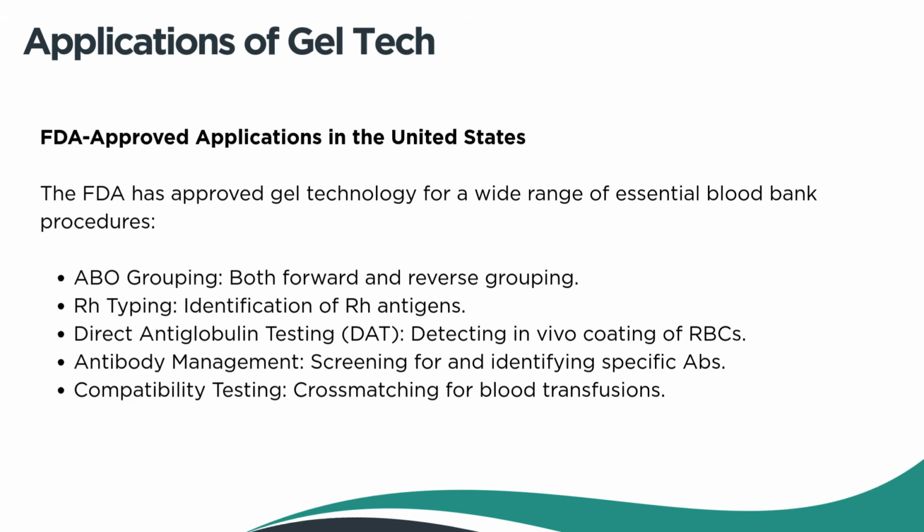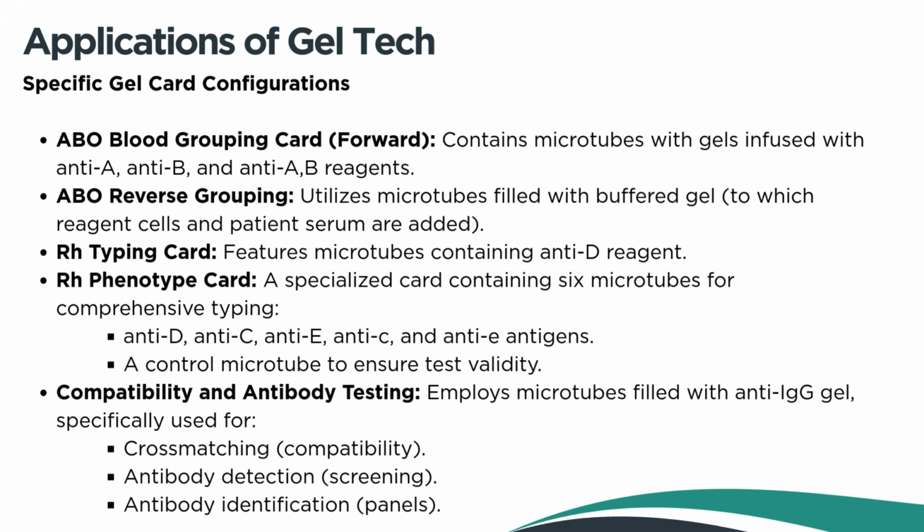We can also have antibody management, so screening for specific antibodies or identifying potential incompatibilities before transfusions. And compatibility testing or cross matching, which confirms donor-recipient blood compatibility, preventing adverse reactions. So that's it for this slide.